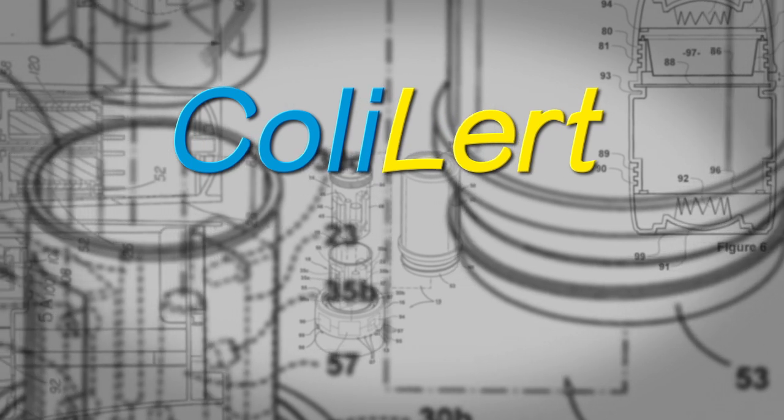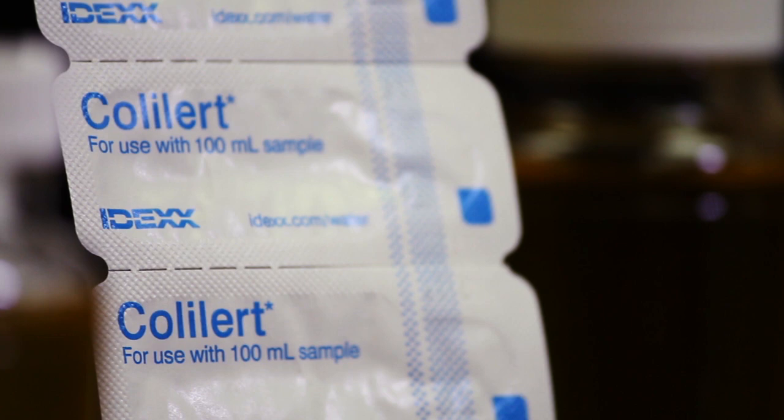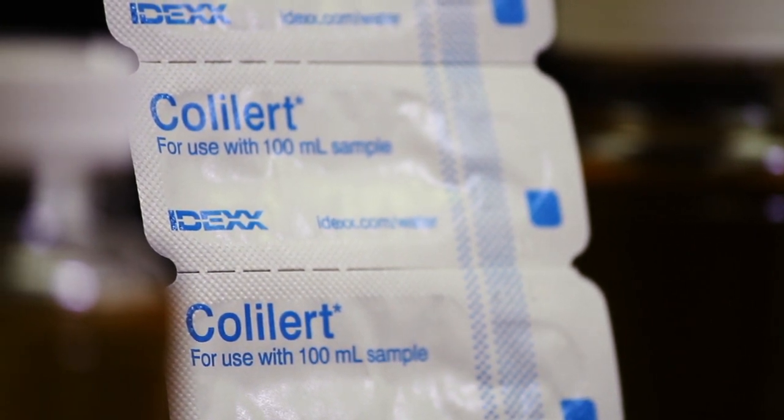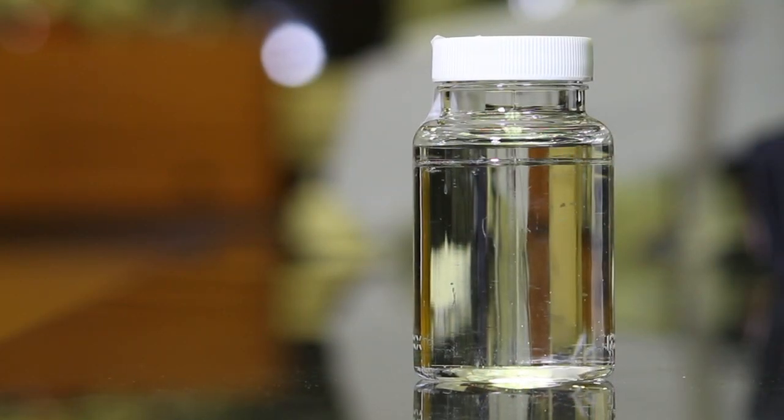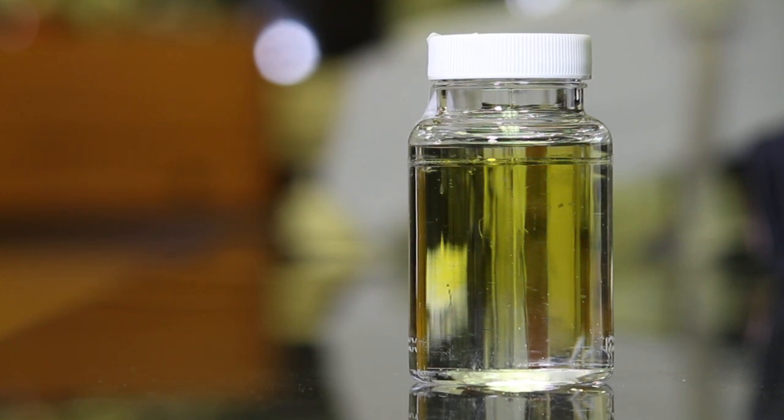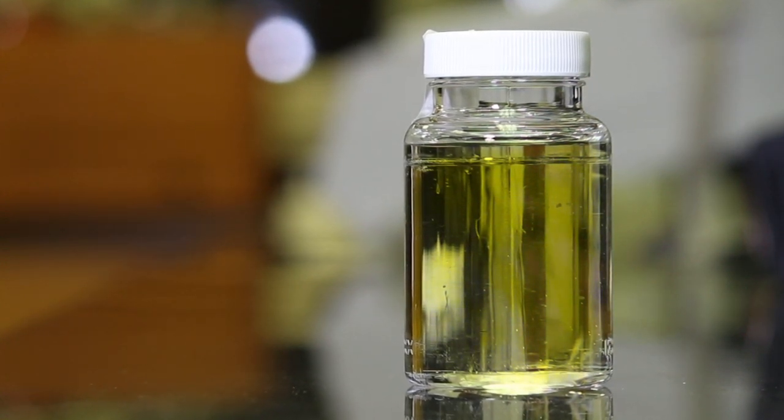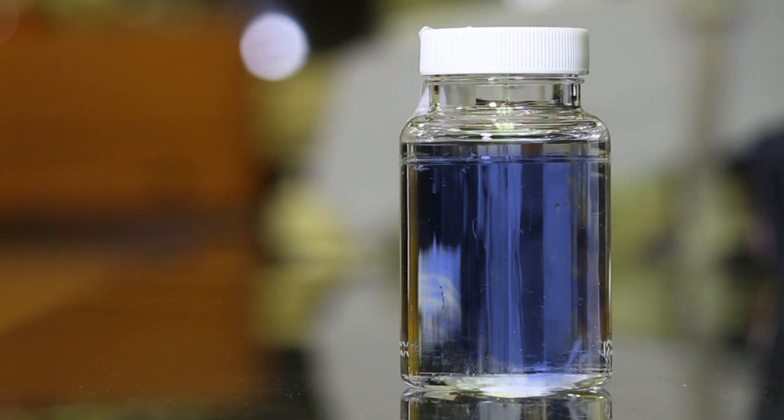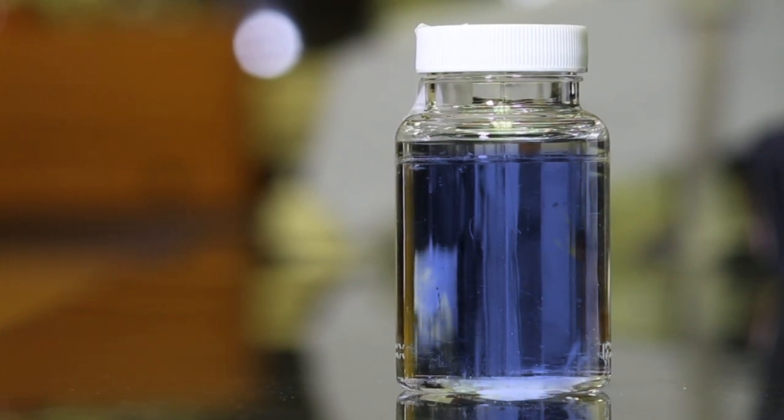Colalert is the newest of these three methods and has been used to determine the safety of water supplies for over 20 years. In this simple method, we look for color changes in our test vial to determine if total coliforms and/or E. coli are present in a water sample.